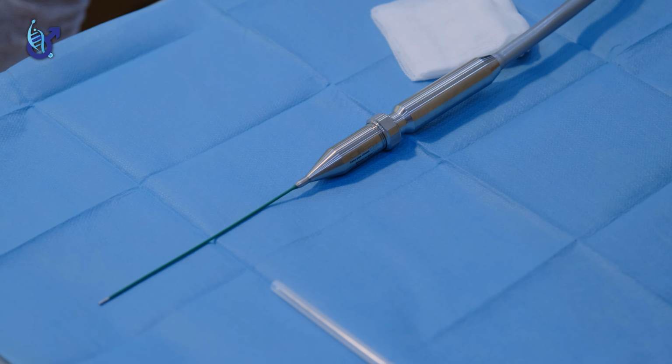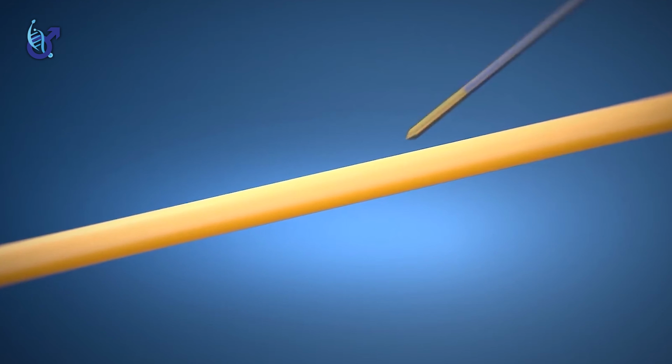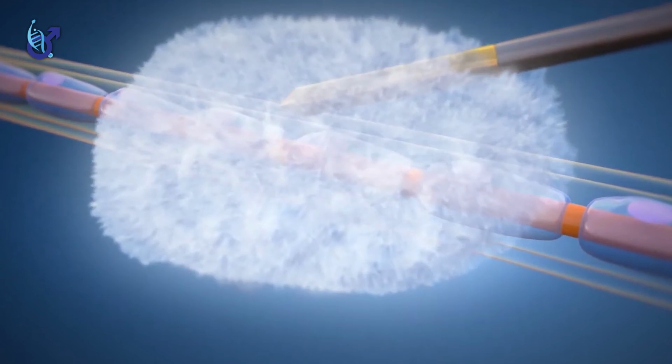How are we ablating the nerves? We are using some special probes which have a temperature of -78 degrees, and we apply this special cryo treatment to nerves of the penis. We apply this treatment to 4 special areas of the penis, which are located on the dorsal part of the penis, which faces our face, on the top part of the penis, and we are trying to ablate some of the nerves.